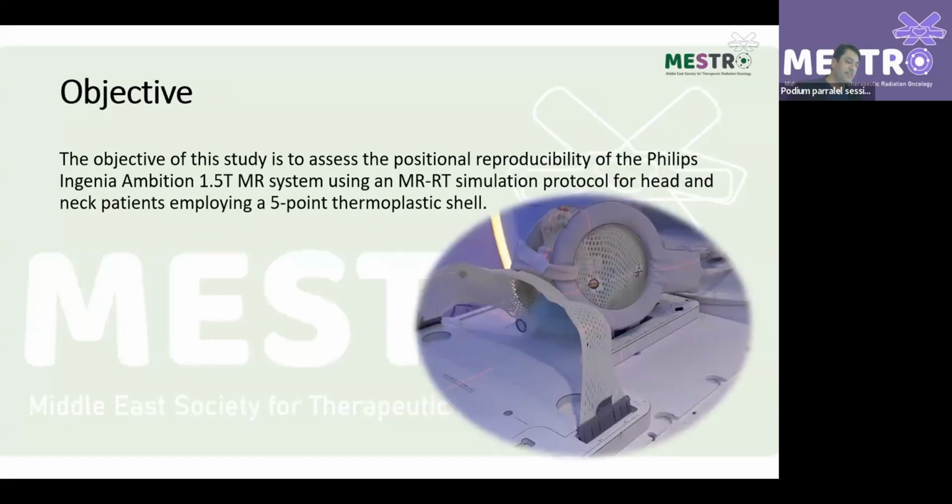The objective of his study is to assess the position reproducibility of the Philips Ingenia Ambition 1.5 Tesla MR system using MR radiotherapy simulation protocols for head and neck patients using this 5-point thermoplastic shell. This is the picture of his setup which he used for his study.